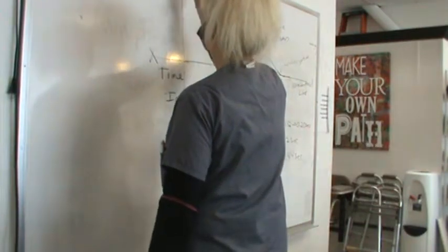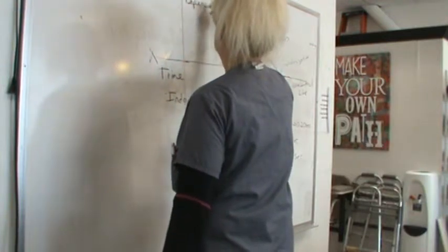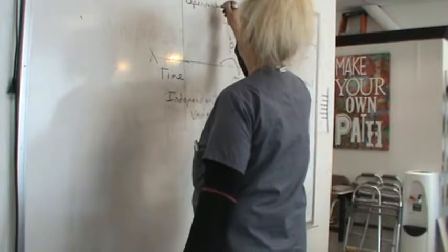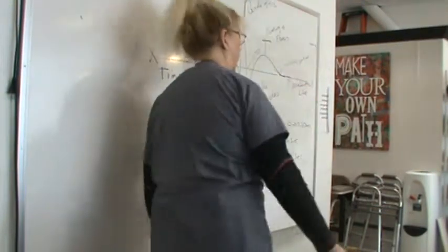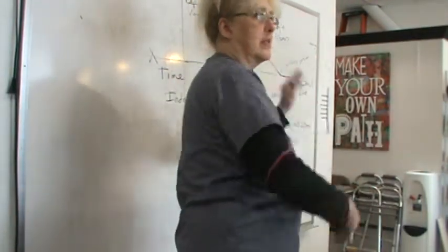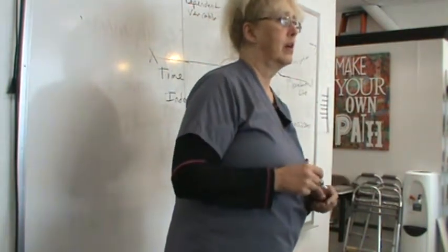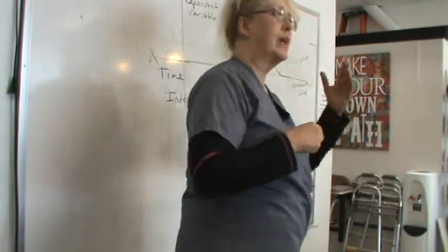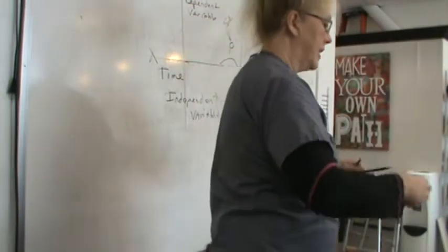The Y-axis is in electrical voltage, and this is a dependent variable. Okay? Not that that's really going to help you too much, but you know your X's and Y's. You always have to measure horizontally with your calipers. So this is what we've got. How do we measure? Well, basically this is how we measure. We take our calipers.